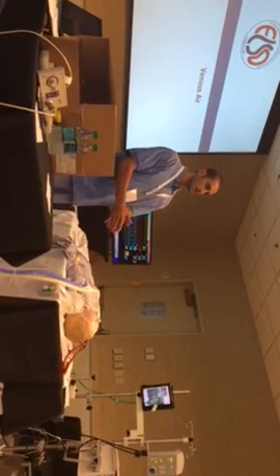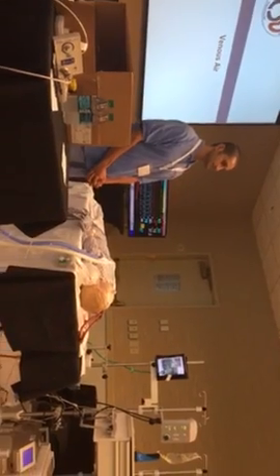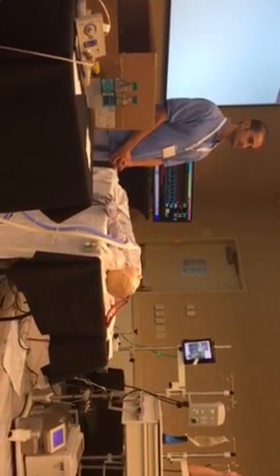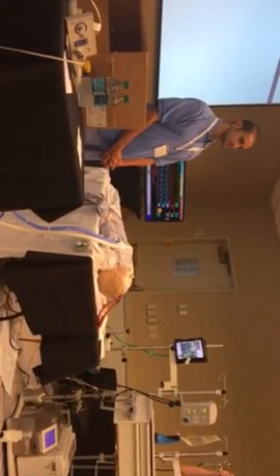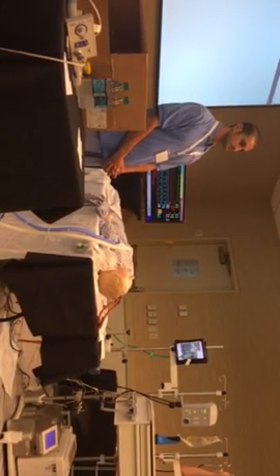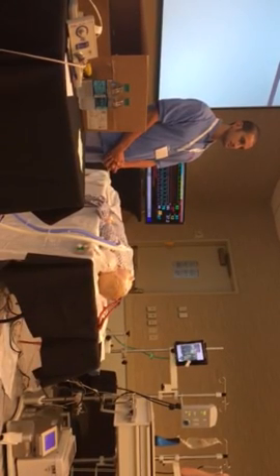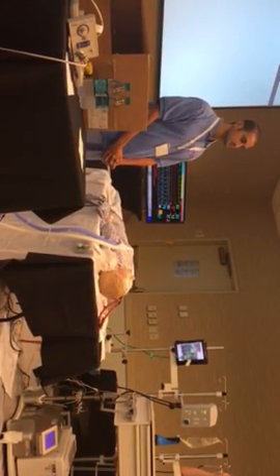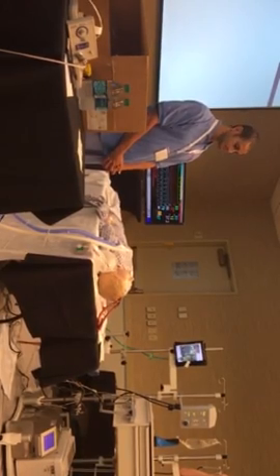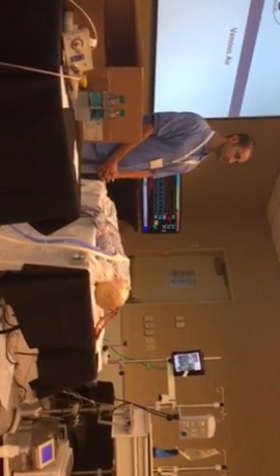Good. Can you summarize the case for us in a sentence, just to make sure we're all on the same page? The catheter position caused error in the system, and until the catheter position was fixed and the error was taken out, Good. So patient on VV ECMO with air embolus, likely related to catheter issues.